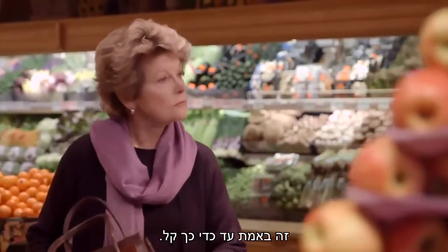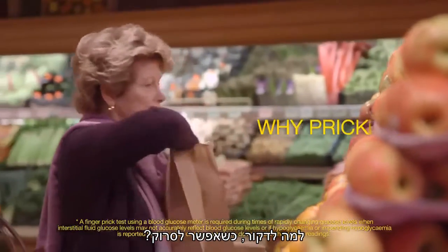It really is that simple. Why prick when you can scan?